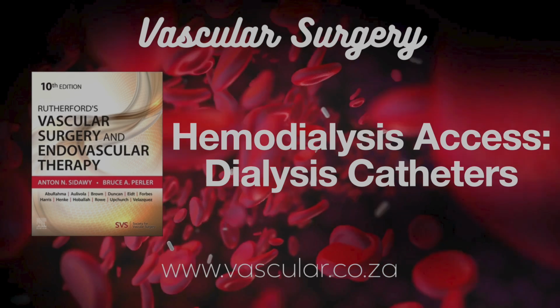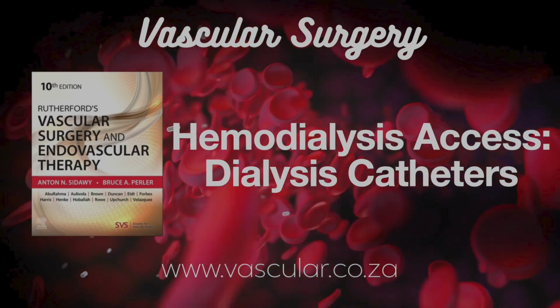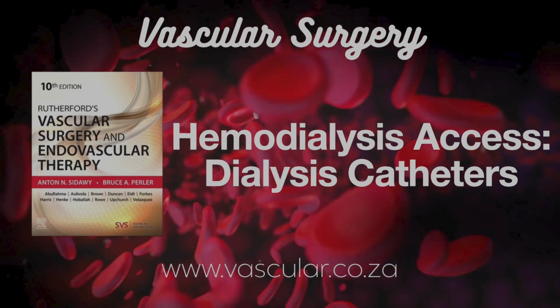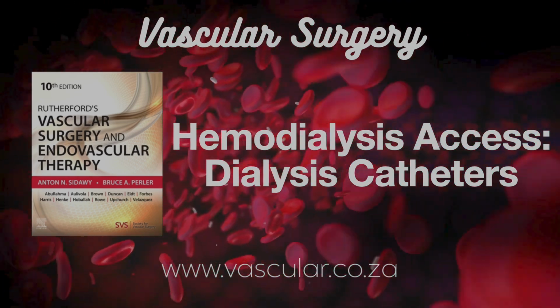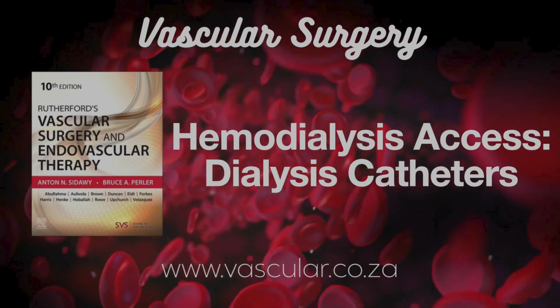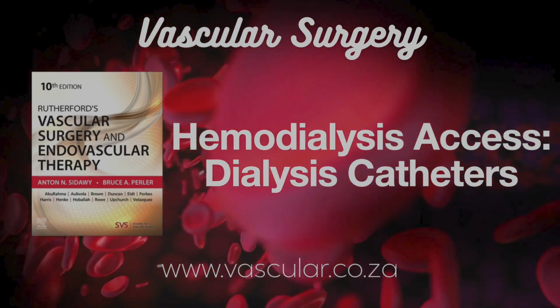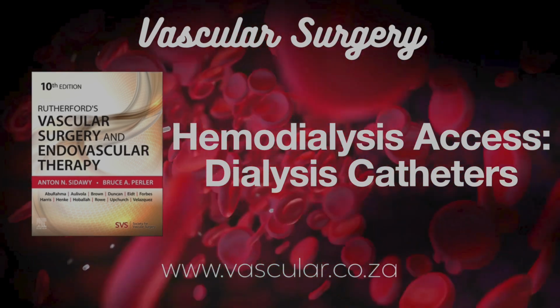When do you absolutely have to take the catheter out? Simple exit site infections might resolve with just antibiotics, but definitely remove it immediately if the patient's unstable, if fever, bacteremia persists despite antibiotics after 48-72 hours, if there's metastatic infection, if it's certain bugs like Staph aureus, Pseudomonas, fungi, or if the tunnel is clearly infected.